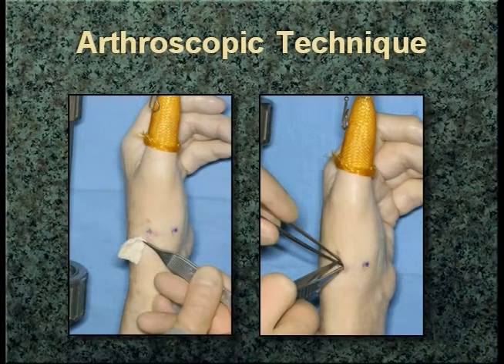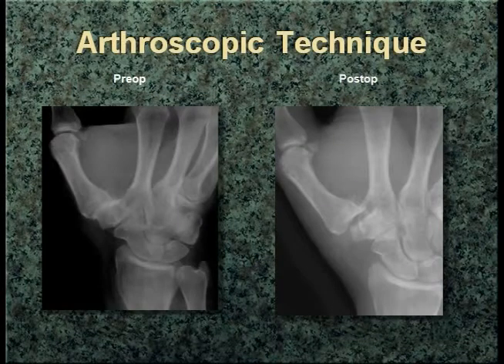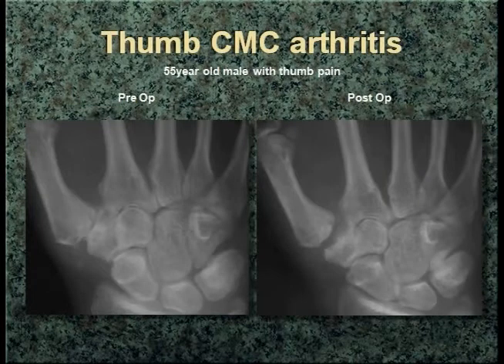Here you can see the graft being placed in, and I would caution against making the portals too big. I have a couple of instances where the graft patient came back in two weeks and I'm looking at a little piece of the graft — the Kleenex is starting to come out of the box. If you make a small portal, it tends to trap the graft in there, placing it into the spica cast.